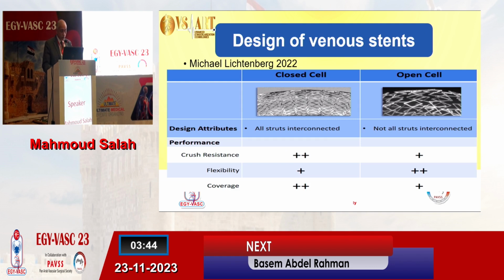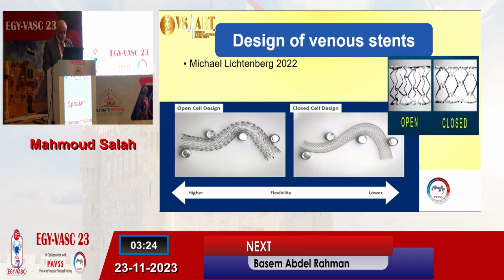We have closed cell and open cell venous stents. The closed cell is more crush resistant than the open cell, while the flexibility is better in the open cell than the closed cell.